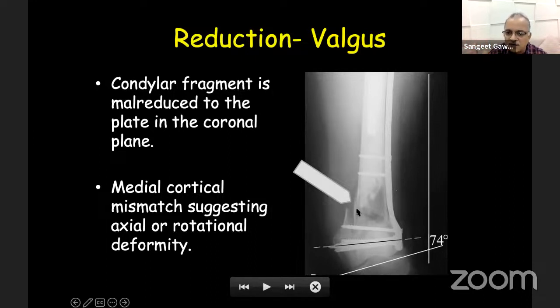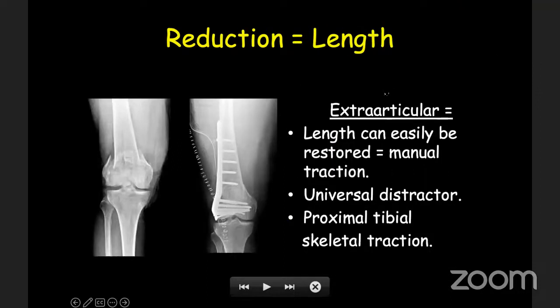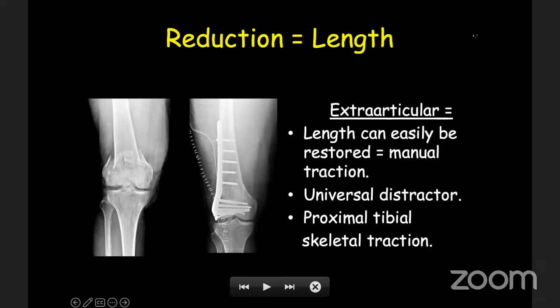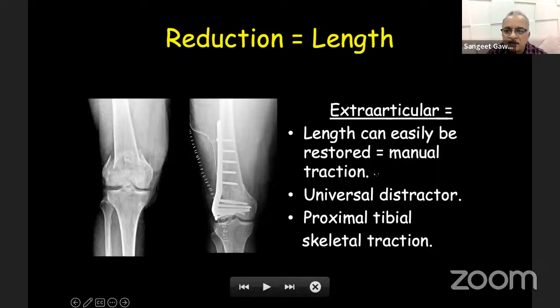If the distal fragment is rotated, you'll see a fracture gap suggesting either an axial or rotational deformity. Length can easily be restored by just manual traction or a universal distractor or a proximal tibial pin to get a reduction like this in simple fractures.